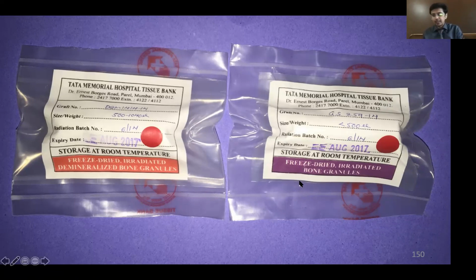Both FDBA and DFDBA are good. DFDBA is osteoinductive. It induces bone formation because of BMPs. Let's not go into the details. FDBA is only osteoconductive, but clinically the results of FDBA are also good. I personally prefer FDBA. The second advantage of FDBA is cost. It is half the cost of DFDBA. Out of the two, using either one is fine. Using an allograft is anytime better around an implant compared to a xenograft or an alloplast. Please remember this; this is the first thing you are supposed to remember.